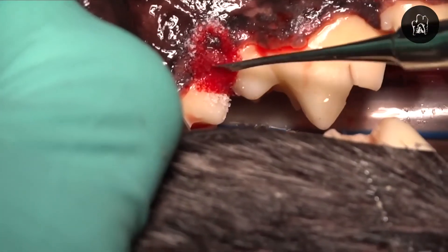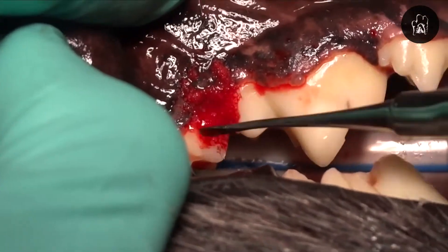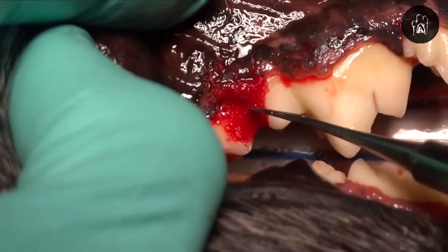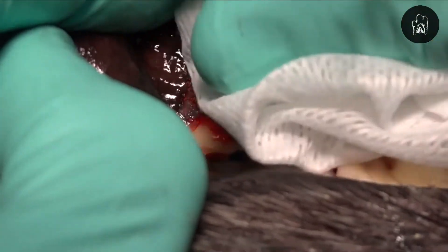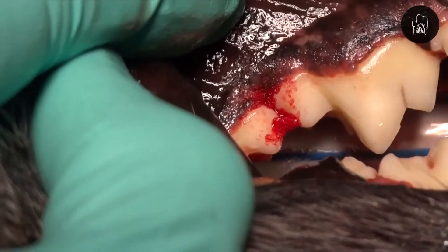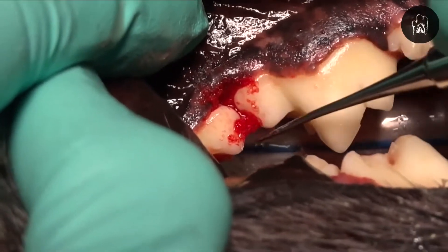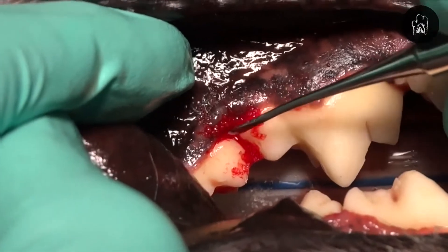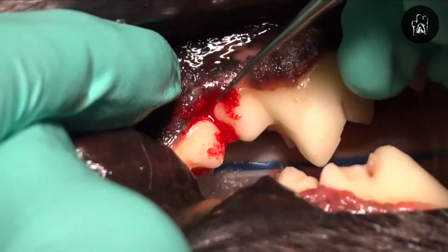Right here we're placing Consil, which is a bioactive silicate glass — an osteoconductive bone graft that we use to maintain the height of the bone where it exists now in the normal area adjacent to that defect. So we want to try to grow that bone back up to that normal area, and we can very predictably do that using these techniques.